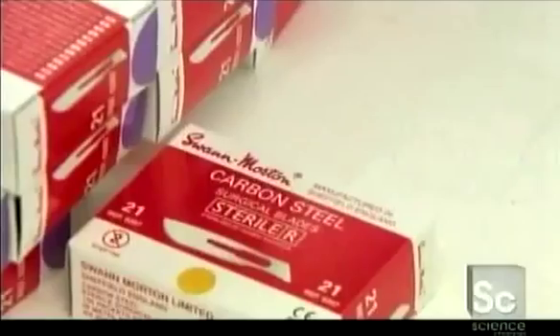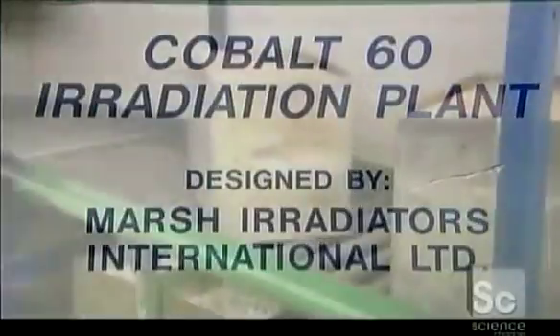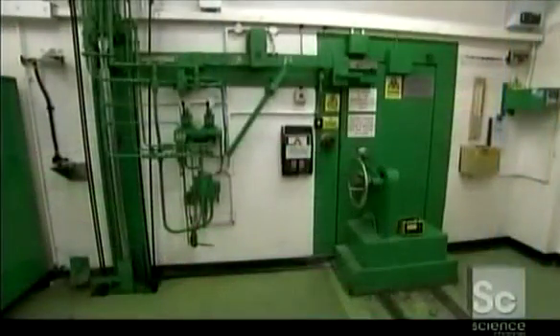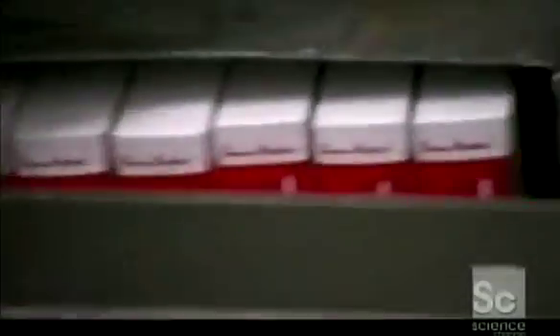It's critical that surgical blades be sterile, so the boxes go into a cobalt radiation chamber for about six hours. This obliterates any lingering contaminants. When the boxes exit the chamber, they're hospital ready.